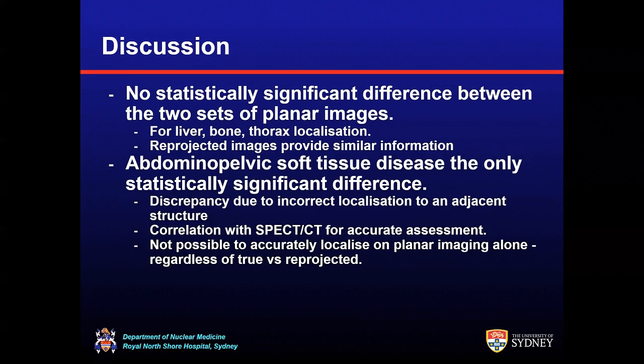Correlation with the SPECT CT data was performed for accurate assessment and was done as the gold standard. There were some lesions that were identified on SPECT CT data only, and so it is not possible to accurately localize them on planar imaging alone, regardless of whether it was true or reprojected data.